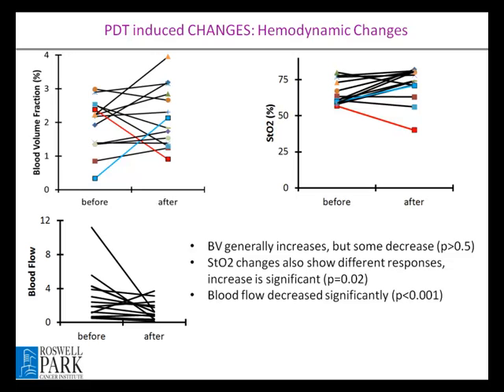This is immediately after PDT? Yes, right after. The reason is that I didn't want to measure, say, 3 hours later, when I don't know the condition of the patient. In the operating room, he is staying still, so blood flow is more robust, I thought. Otherwise, after 2 hours, he may be awake and moving, and it's very hard to measure. So this is only right after.